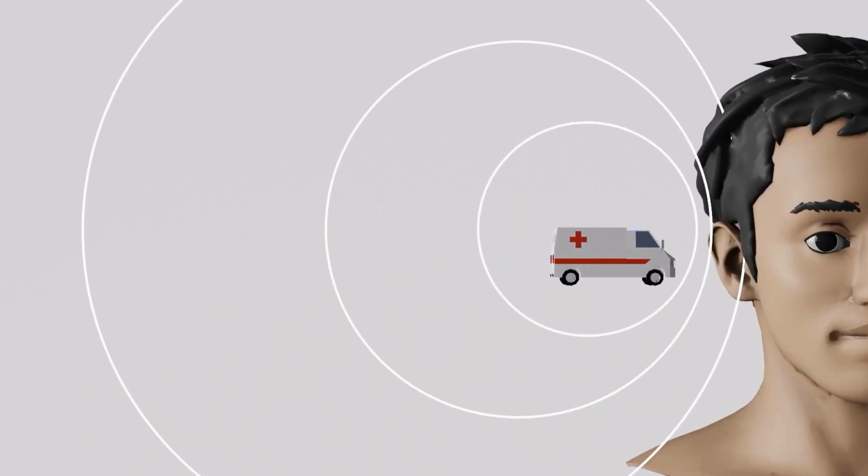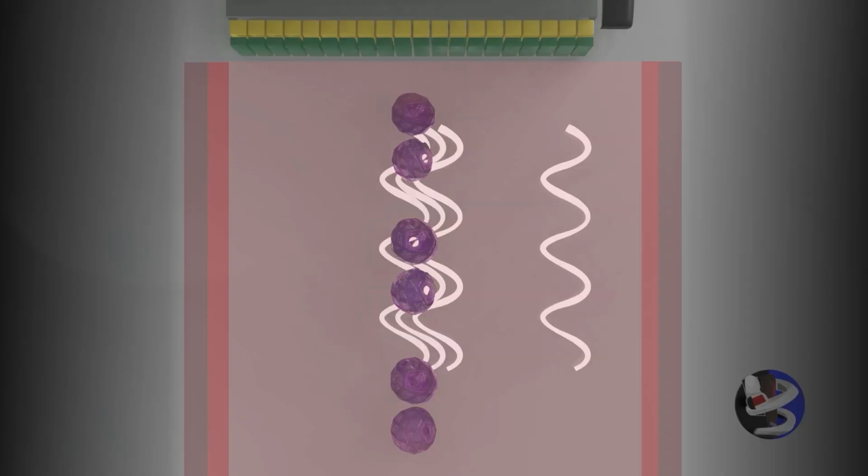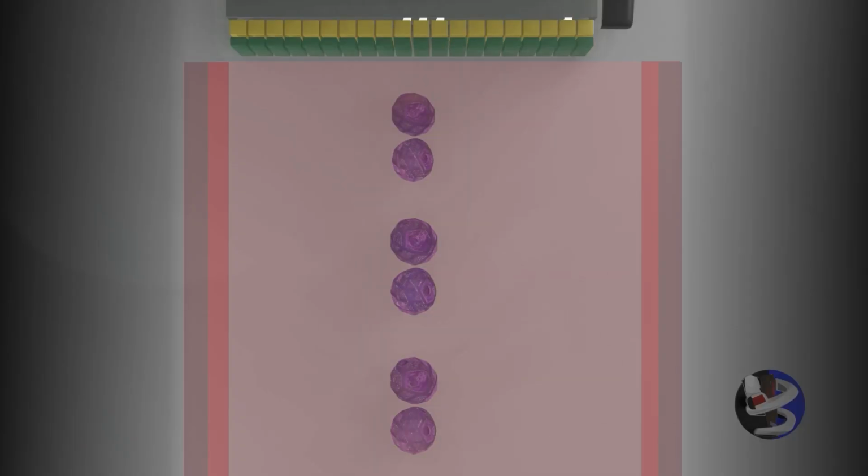The Doppler principle can be applied to determine flow velocities, flow direction, and flow characteristics of the heart and great vessels. For now, let's focus on the basics. The story of Doppler is the study of moving objects. A reflective and moving structure will have an impact on the waveform of the received pulses. As the sound source moves towards the probe, we anticipate an increase in sound frequency. Likewise, as the sound source moves away from the transducer, we appreciate a decrease in sound frequency. This moving target is the red blood cell as it moves throughout the cardiovascular system.